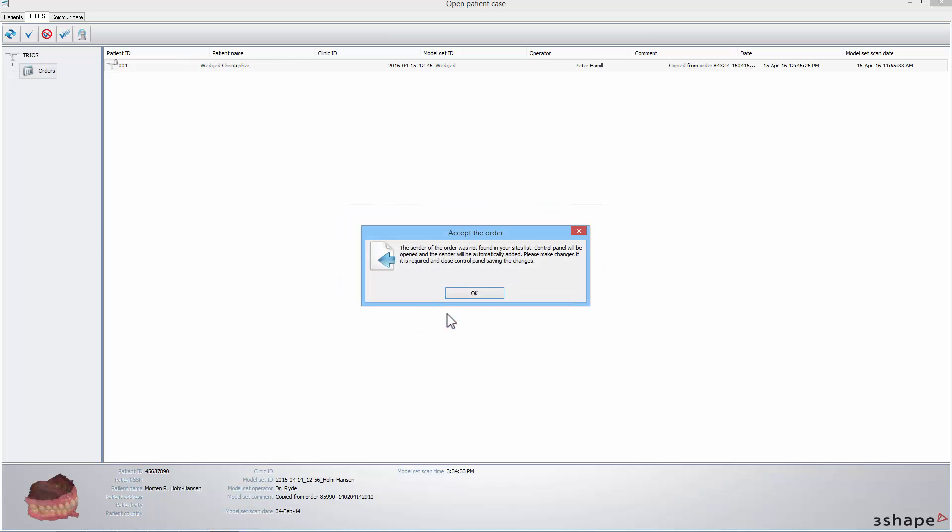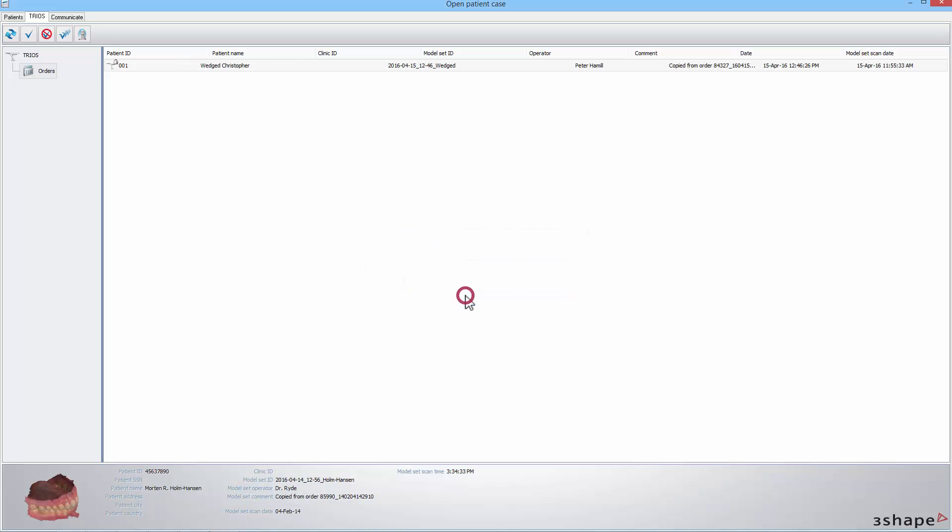In our video, the informing window will show up. It informs the user that the site that has sent the accepted order hasn't been added to the Sites list in the control panel. When you click OK, the Sites page will open.